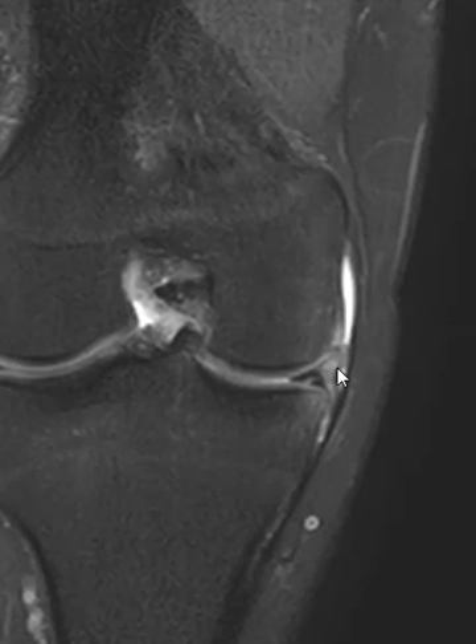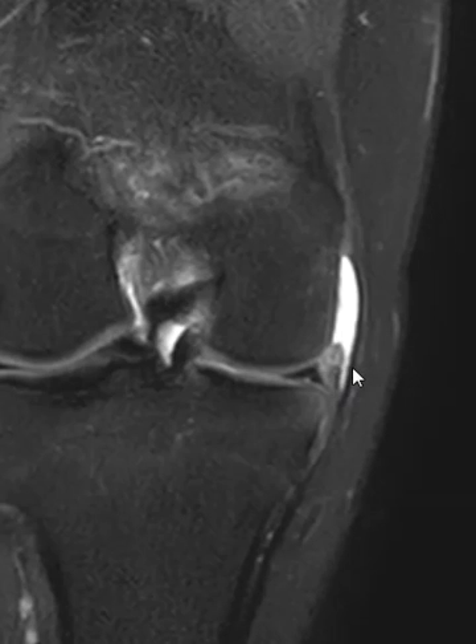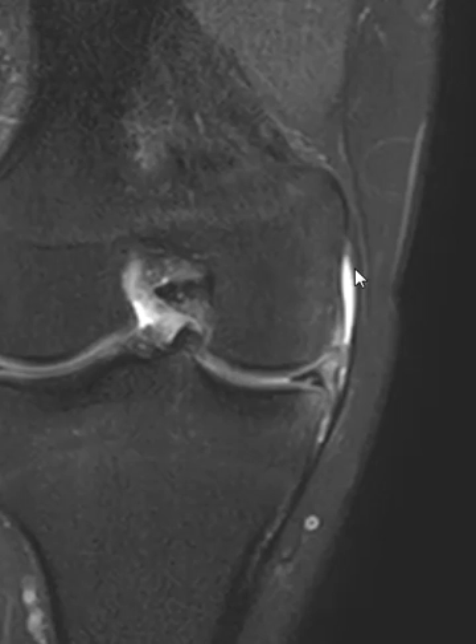Usually I see the inner capsular fibers torn and the outer MCL fibers still intact. So this is a case where this little band here is part of the inner capsular fibers, again usually stuck to the outer fibers. They come up and stop, and they look like they're torn from the femoral condyle here. This may be part of them coming down here. So the outer thick fibers and the inner thinner capsular fibers are separated because the inner fibers are torn.